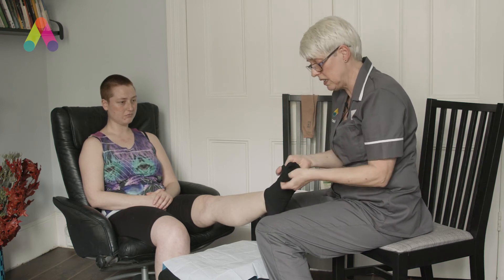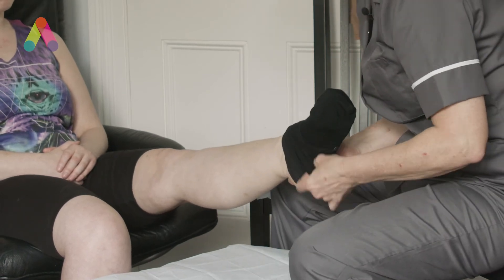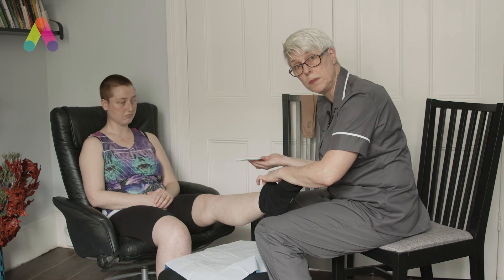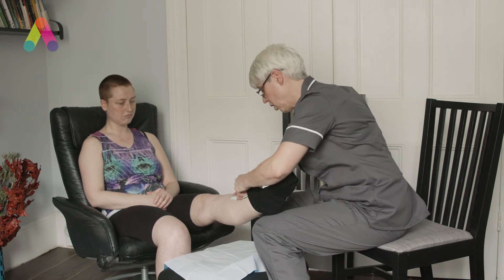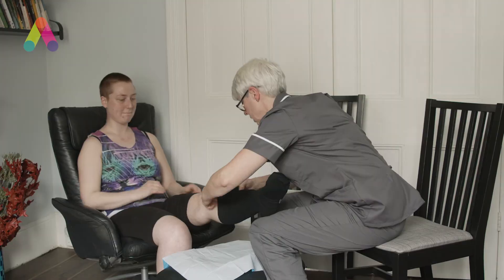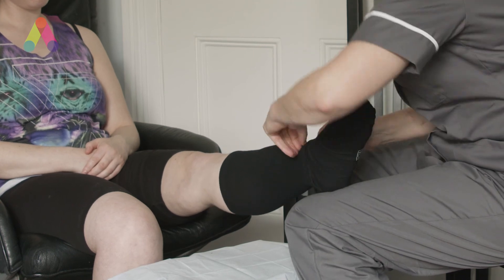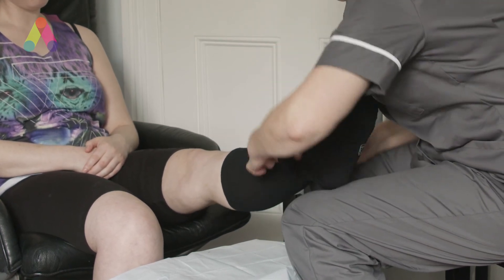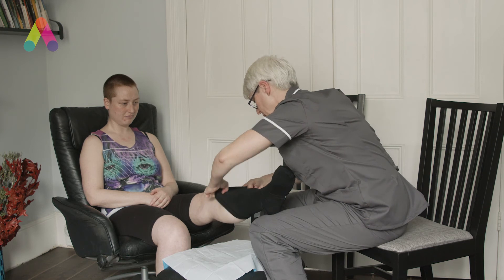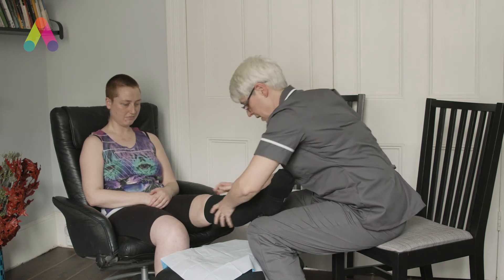The best thing to do is to get the sock on most of the way. Obviously if I was in a clinical situation I'd be using gloves. We would just put that there and hold it there — Faith herself may be asked to use her hand there — and then we'll just edge it up. What you don't want to do is over-stretch these socks, because then they will get tight across the knee. But that's quite a nice fit.